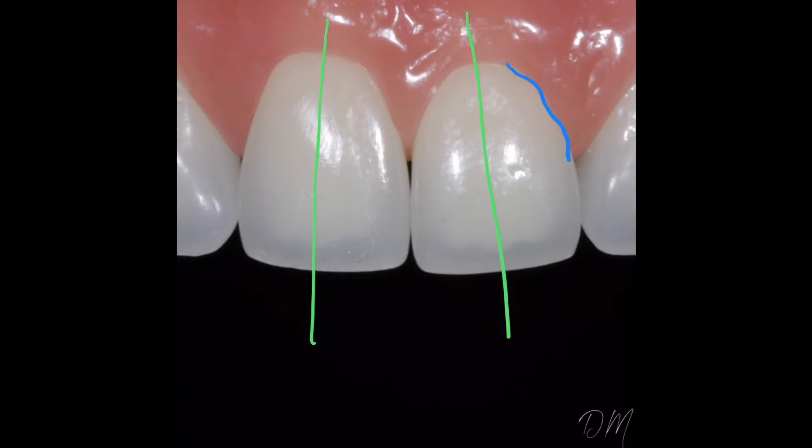So how do we go about fixing this? First, I would try to smooth out that wonky area, try to correct that contour, and smooth out that whole distal line angle. Then I would adjust and contour the mesial line angle to better mirror the mesial line angle of eight.